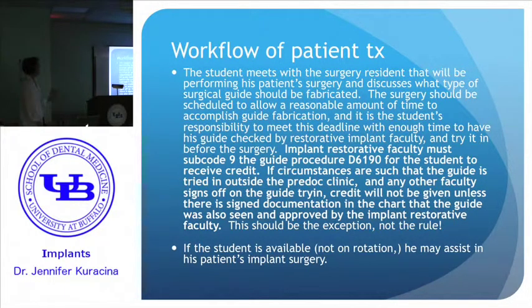Okay, so the patient is then assigned to a surgical resident. The student meets with that resident and discusses what kind of surgical guide to be made. And hopefully the surgery, and this is a bad time of year because patients are being transferred from one student to another, and you need a little time to catch up with things, but we would like the surgery to be scheduled within a reasonable amount of time so that the student can get the guide done and have the opportunity to try the guide in and be supervised doing so.